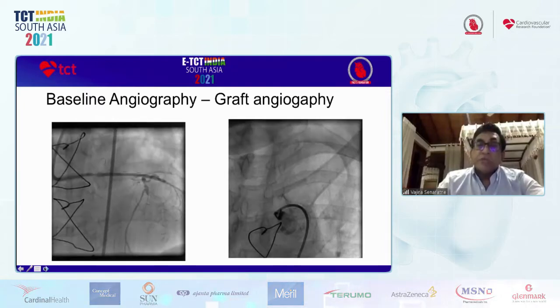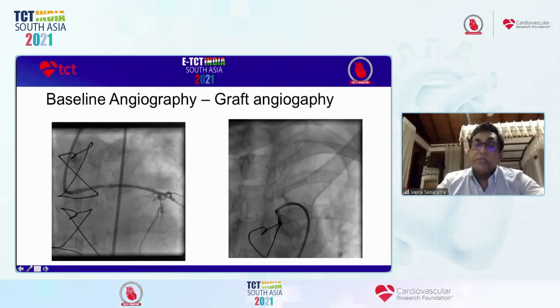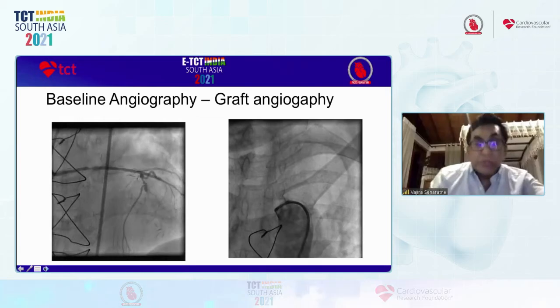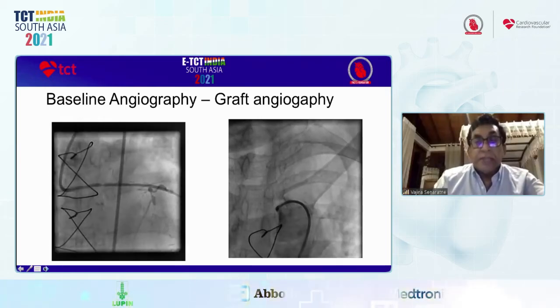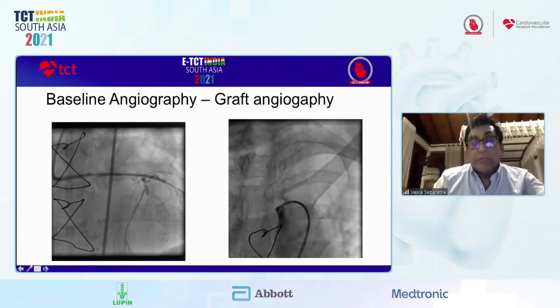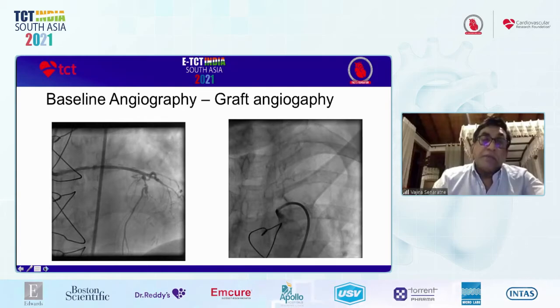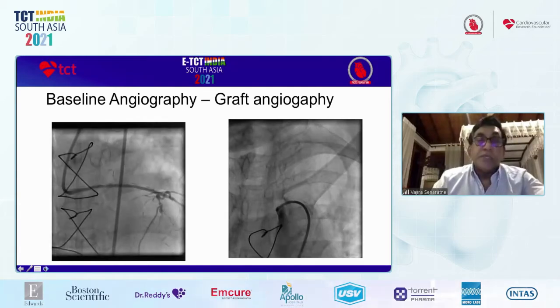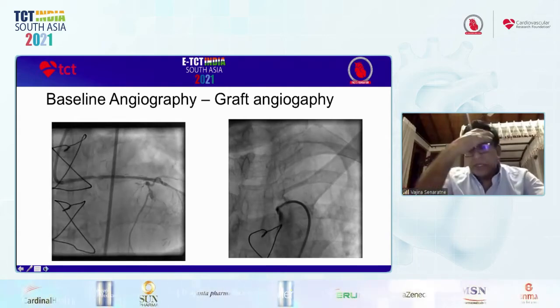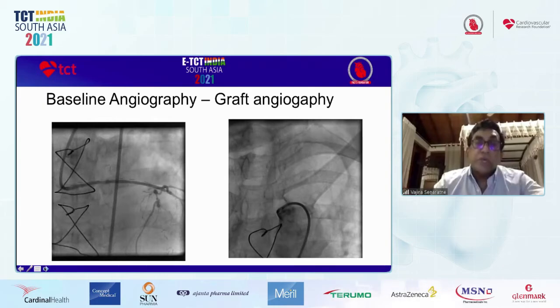And we were trying to engage Lima. Unfortunately, you can see the subclavian artery is totally occluded. So she has three problems. The patient comes with angina, had two grafts. The main problem: Lima is totally gone because the subclavian artery is totally occluded. The radial graft also has a critical lesion, and there is a new lesion in the RCA ostium, in a sizable vessel. So considering the problem, subclavian intervention is not as easy for a current interventionist.